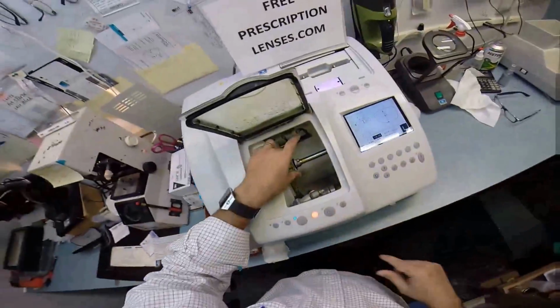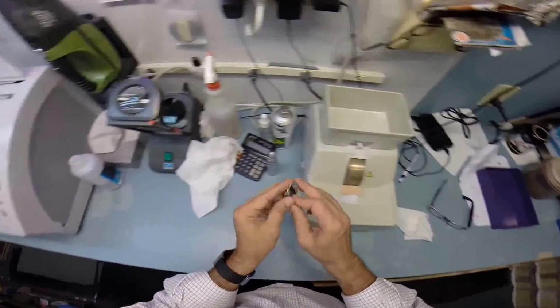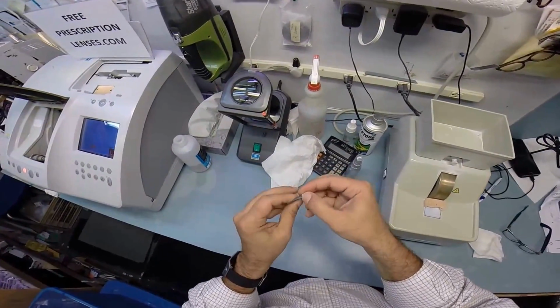And that makes everything nice and crisp. Oop, let me get my glasses out of the way. So back to the hand stone for the safety bevel real quick. Back to scraping that off with my thumbnail.